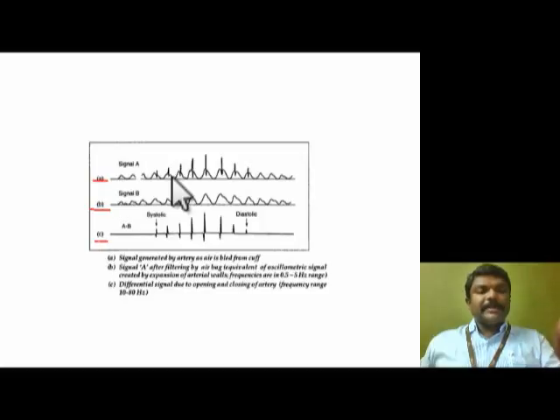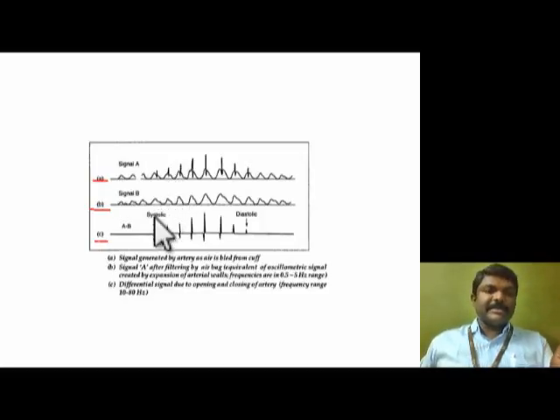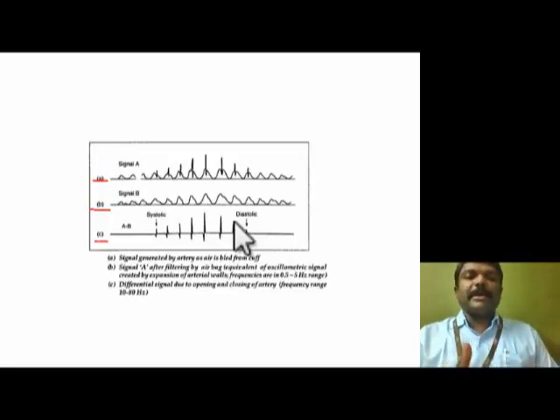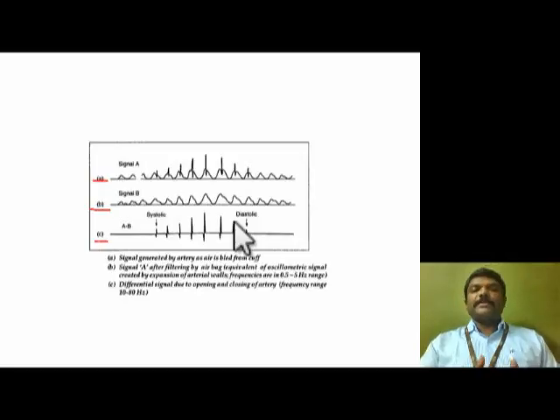The start of that pressure variation is an indication of systolic pressure, and the disappearance of that pressure change is the diastolic pressure. This way, there is no manual interruption, so the manual error is reduced. If you use a highly sensitive pressure sensor, the accuracy of the measurement will be high enough that we can make decisions based on these measurements. So this is the differential pressure sensing method.